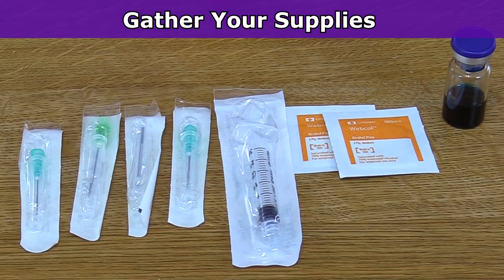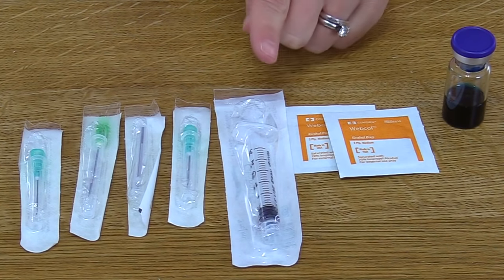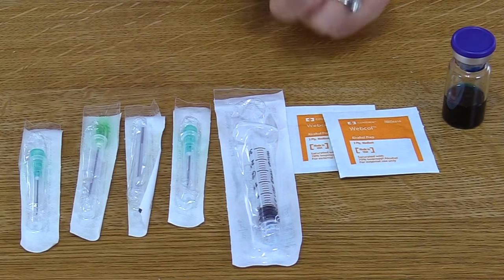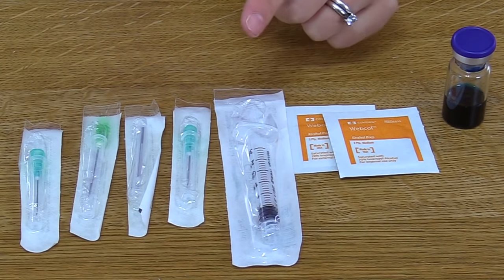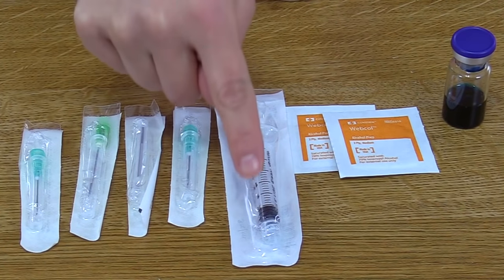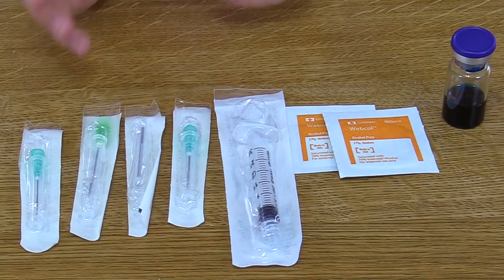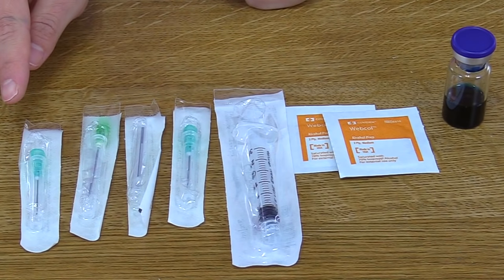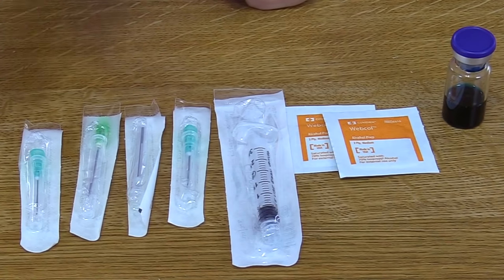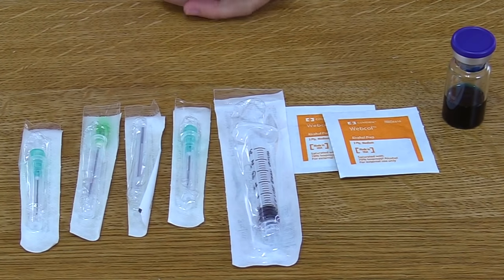First, gather your supplies. Look at your physician's order and see what medication is ordered, then get the correct medication in its vial. You'll also want to grab some alcohol prep and a syringe — the size of syringe depends on how much medication you're giving. We're giving two ml of medication, so we grabbed a three ml syringe. You also need a vial access device to attach to the syringe's needle adapter to withdraw the medication, and an extra needle to actually administer the medication.